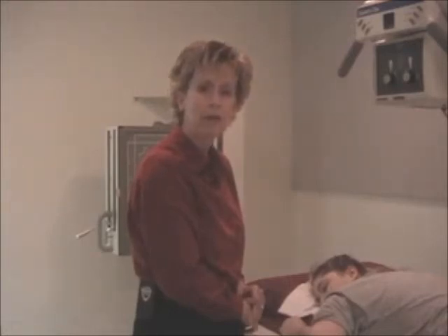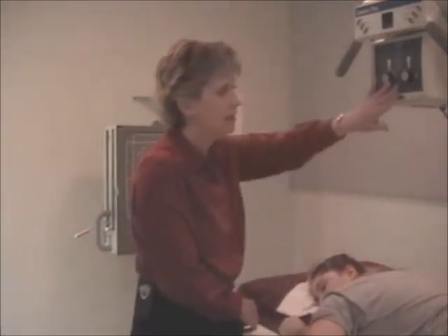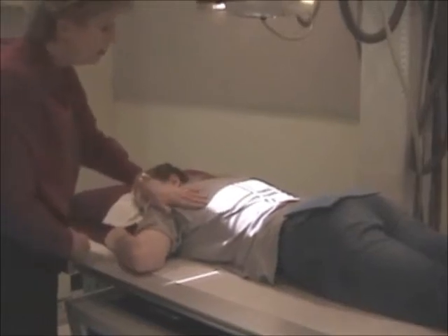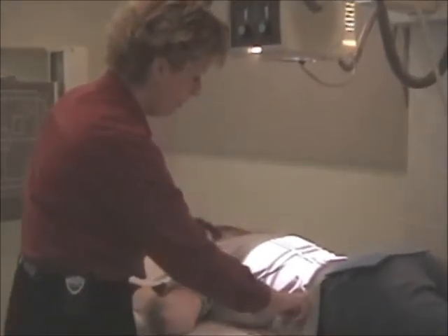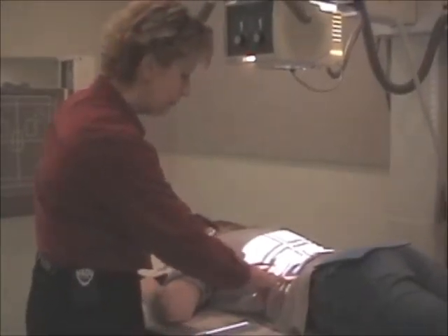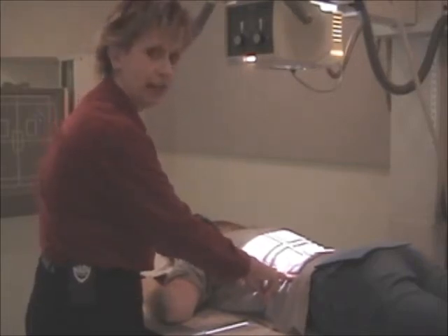You've got average, above average, slightly below average, and then you have tiny. Okay, let's focus on Kristen's back, because it's really easy to demonstrate on a PA what we would do for the various body habituses. Again, this is a sthenic setup. You've got the tip of your scapula, your iliac crest, and you're halfway. Well, if Kristen was overweight, she would be considered hypersthenic.